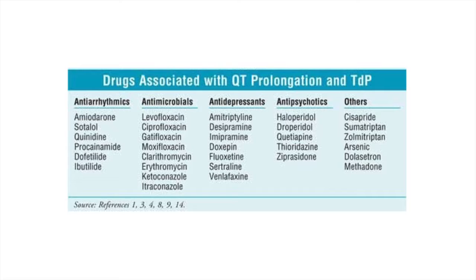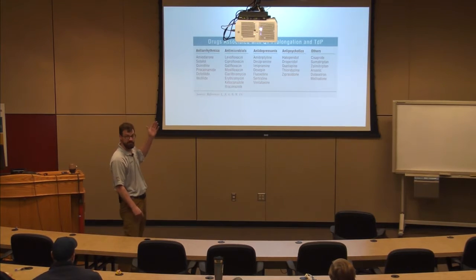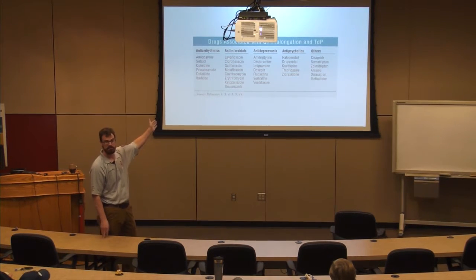A couple of the itraconazole, ketoconazole, these are antifungals. But the joke is someone comes in and you find them and they're like, oh, I just overdosed because life's so difficult, right? And you look and it's an antibiotic. And the joke is, well, you won't get a UTI for the next month. Ha ha, let's go, right? It's purely psych. The truth of the matter is, this could be a cardiotoxic overdose. That person could be at risk for torsades. And how am I going to gauge what their risk is? I'm going to look at the QT interval, okay?